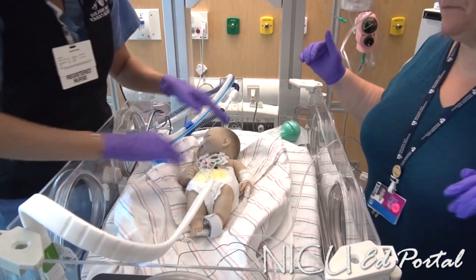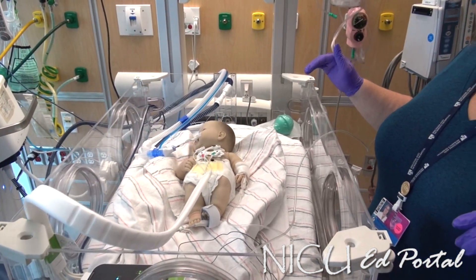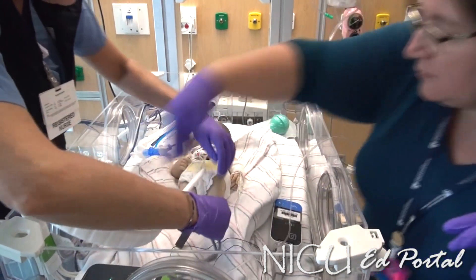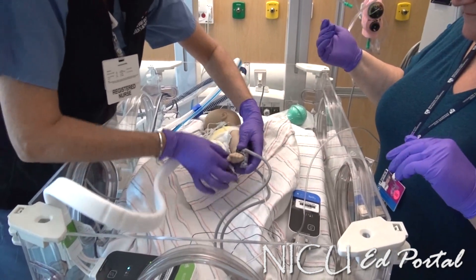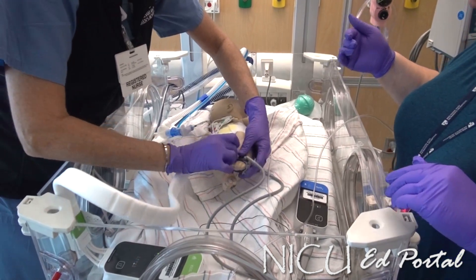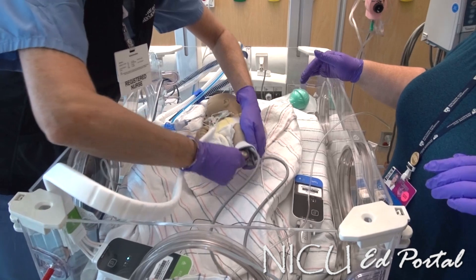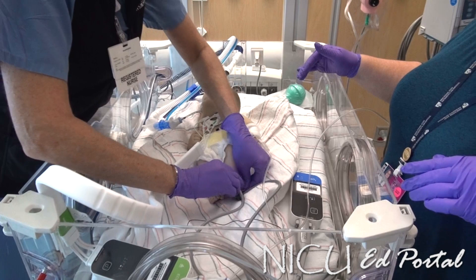We also have to put him on an O2 monitor that's compatible with the MRI on this floor. Tina's helping me out today — she is the NICU MRI expert. Let's put that probe on; it should start picking up remotely any second. I do like to use this particularly if the baby has nice big healthy feet, like little Patrick here. We put this on to hold it in position.